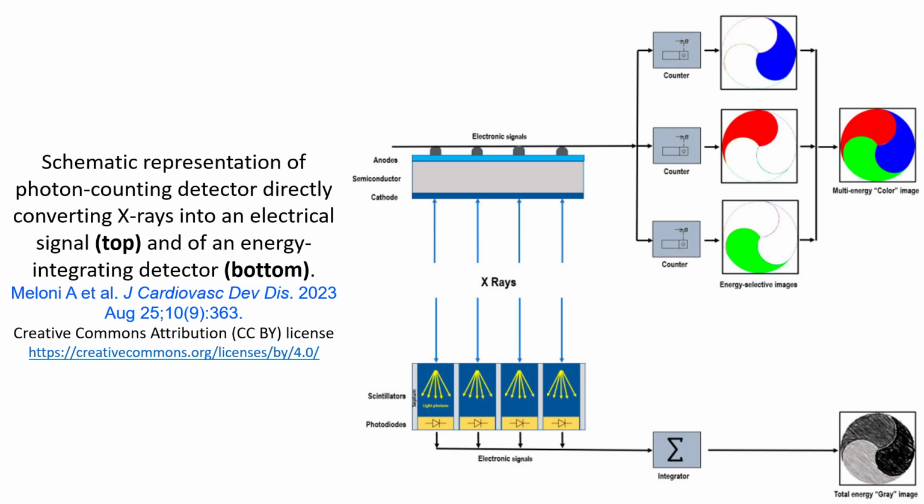The individual conventional CT detector cells are divided by optically opaque layers called septa. These are inactive areas of the detector surface causing loss of efficiency. Instead of the two-step conversion in conventional CT, photon-counting CT uses direct conversion using a layer of semiconductor.